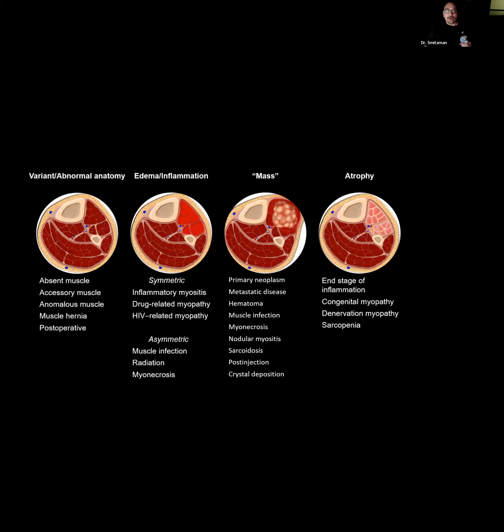Okay. But as I want to harp right on you guys, please, please, please don't forget clinical information, as a lot of these diseases can cause overlap. It's a spectrum in its presentation, depending on when we catch it. MRI helps us to plan biopsy and obviously can help to guide appropriate management. Remember to think of our anatomic muscle variants, accessory anomalous muscles, anomalous courses that can be easily overlooked, especially because they blend with the remaining muscle.